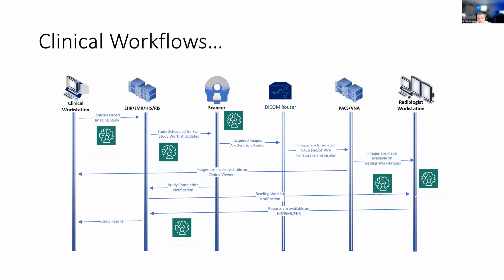We'll look at the additional information on the hospital information system, we'll write a report, and that report most likely will go back to the hospital information system for viewing of the clinician who ordered the exam. That's the most common traditional setting. In different settings, this flow can have some parts skipped or changed here and there.